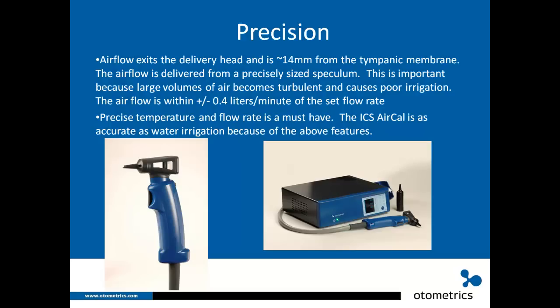Here on the left-hand side we have the irrigator head without the speculum on it. There's a little bit of plastic that protrudes out — that's where the air is coming out of the head. That section ensures the volume of air is correct and does not become turbulent. The upper part is the viewing area where you view the eardrum through the otoscope head, providing a nice viewing angle as well as precise air flow.